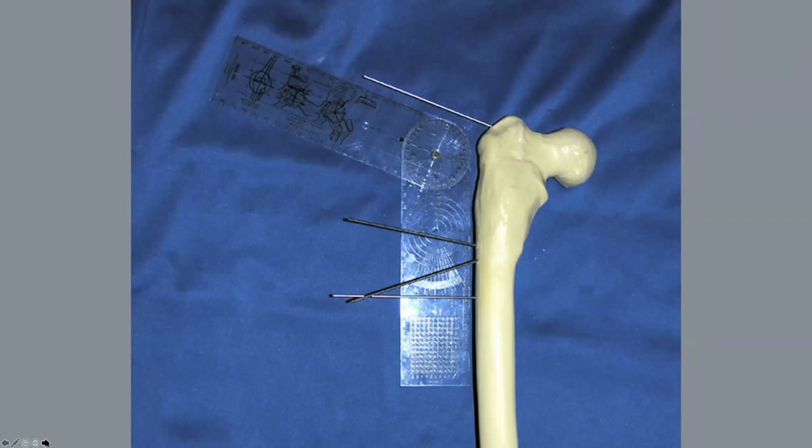And then again, a sterile goniometer intraoperatively is extremely valuable, especially because you have to look way at the top of the trochanter to put this final pin in to guide your blade plate seating chisel. And that's a long way to use your eye to calculate where that pin goes in based on one of those small triangles. So I do think a sterile goniometer is very helpful.